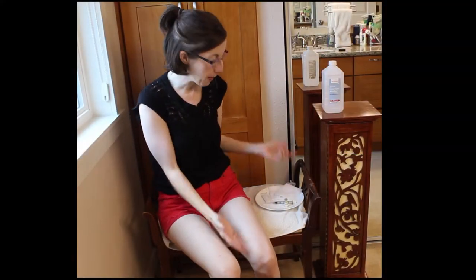Hi everyone! This is Cheryl with Arthritis Life. Today I'm going to be showing you how I give myself my weekly methotrexate injection.